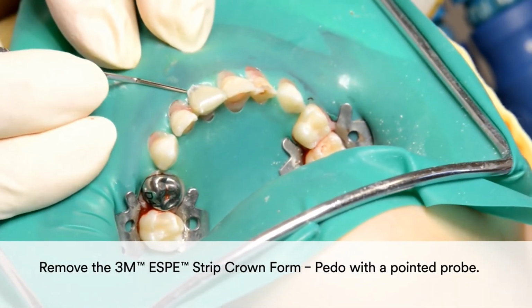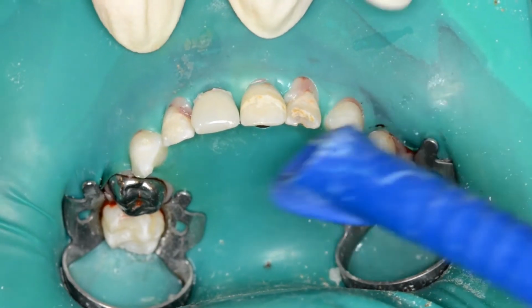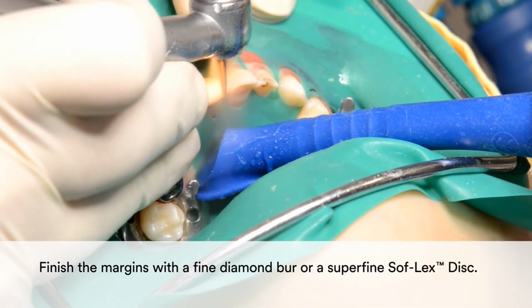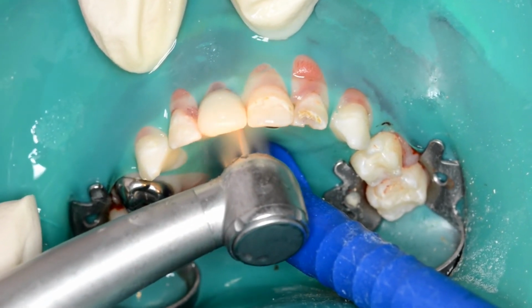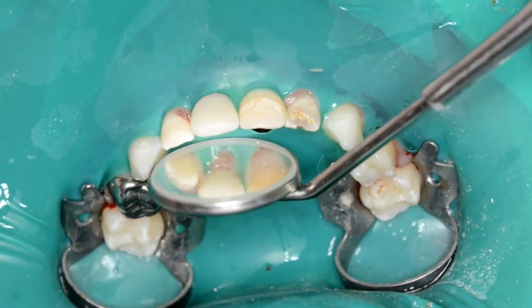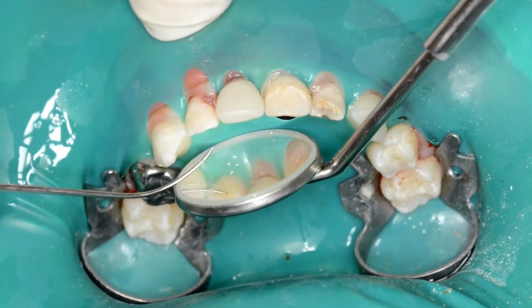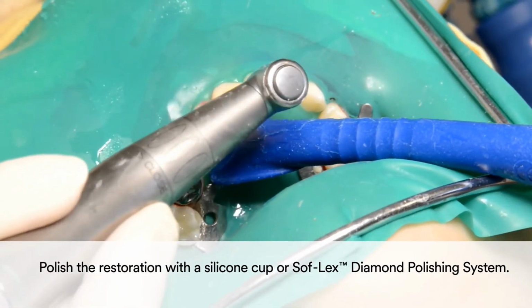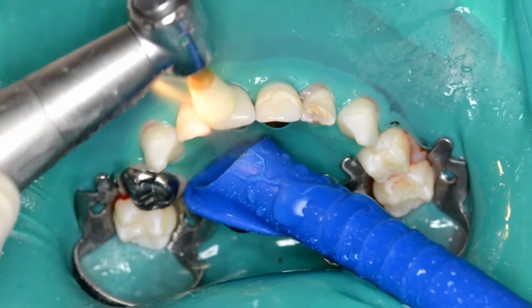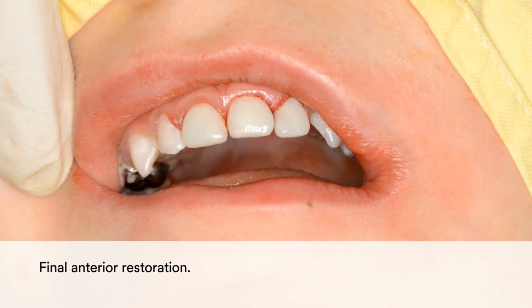Remove the 3M strip crown form with a pointed probe. You may finish the margins with a fine diamond bur or a superfine Sof-Lex disc. Finally, polish the restoration with a silicone cup or the Sof-Lex diamond polishing system. The result is a quick and simple yet highly aesthetic and natural-looking anterior restoration.